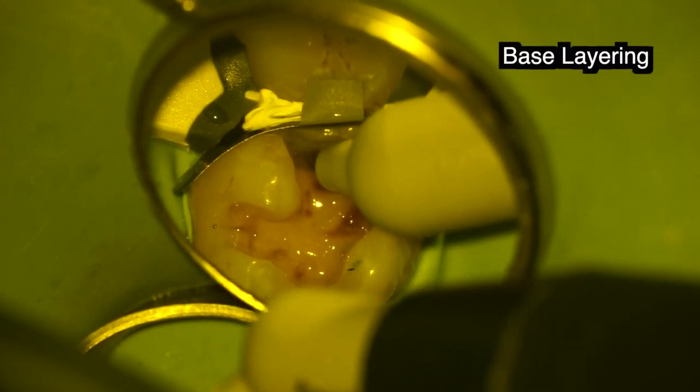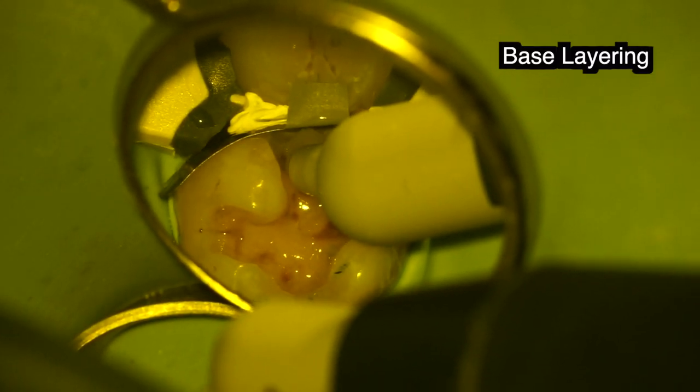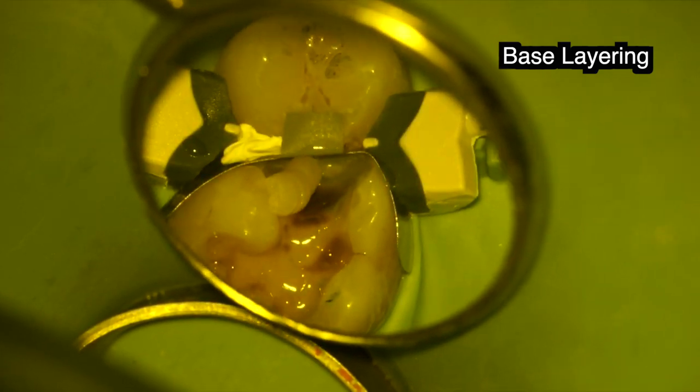Bonding is ready, time to start filling.